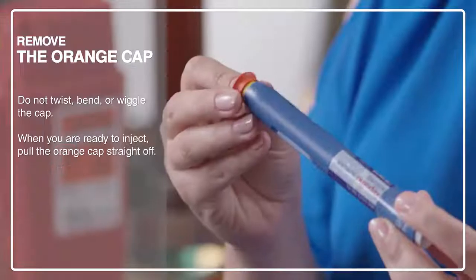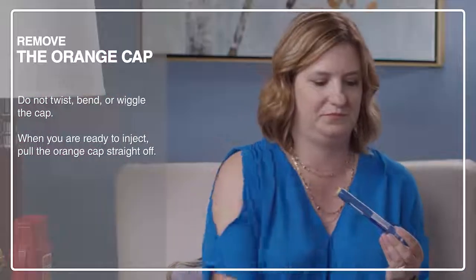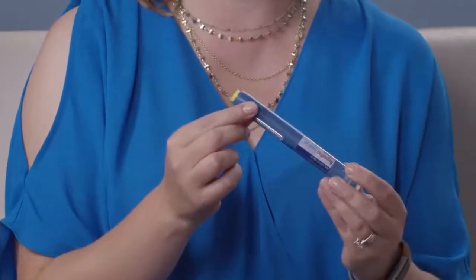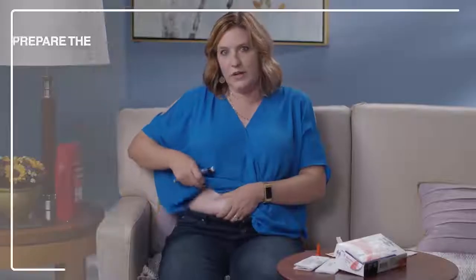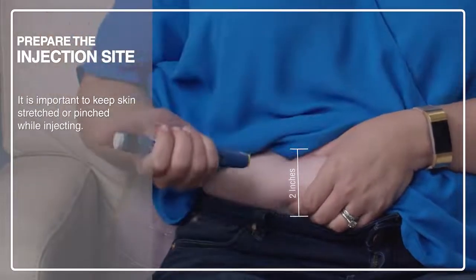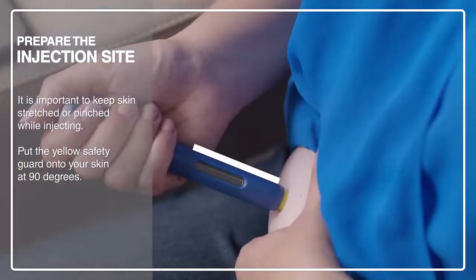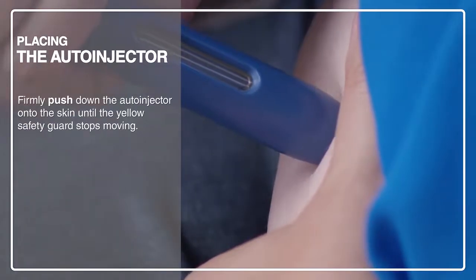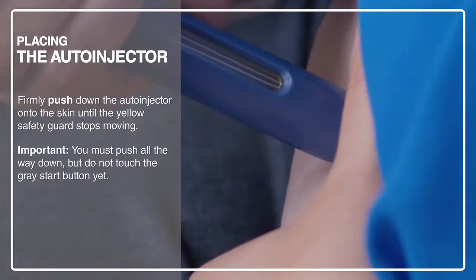When you're ready, take off the cap. You may see a drop of liquid on the yellow needle guard or on the tip of the needle — that's okay. Pinch an area of skin about two inches wide. Place the auto-injector on your skin at 90 degrees. The needle is inside the yellow safety guard — do not touch the gray start button yet. Position it in your hand so that you can see the window. Firmly push down the auto-injector onto the skin until it stops moving, or else the gray start button will not activate.